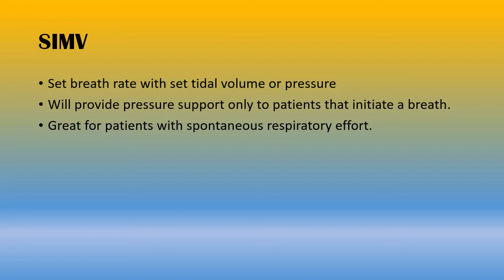So it's great for patients that have spontaneous respiratory effort. I think we're going to see this used a lot more now that evidence-based medicine suggests that long-term paralytics are bad for patients. So if your patient's not paralyzed and they have the ability, or the ability in the future, maybe if the sedation starts to wear off, to initiate breaths, you really want to have them in SIMV.